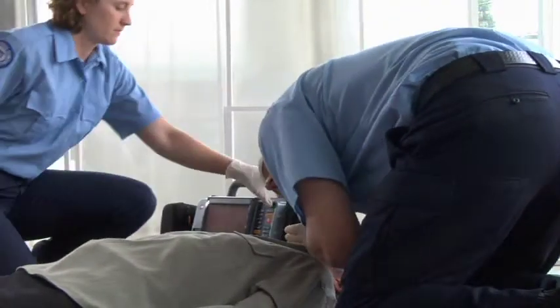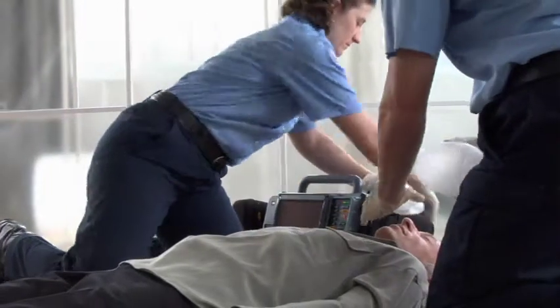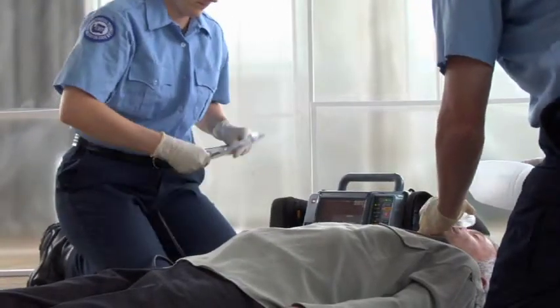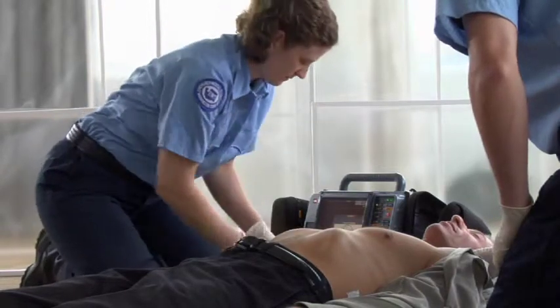So, let's begin. You have an unresponsive patient. Verify the patient is not breathing normally and has no pulse or other signs of circulation. Turn on the defibrillator. If you can, get the patient onto a hard surface and away from any standing water. Bare the chest. Prep the skin if necessary, as we described in the ECG monitoring section.